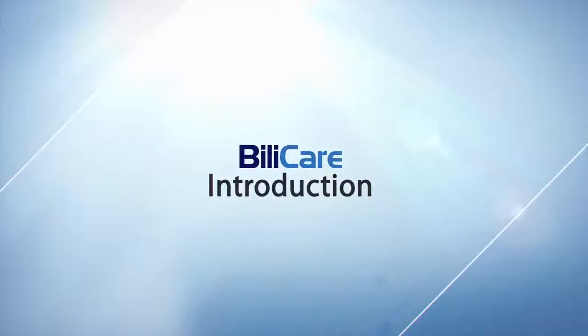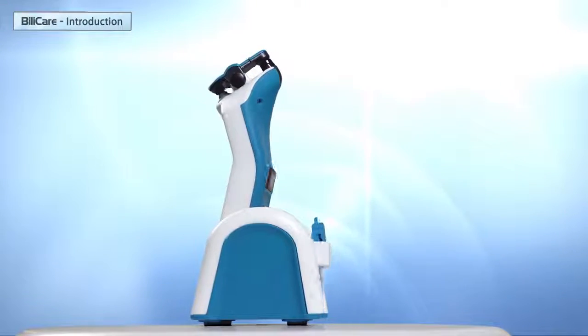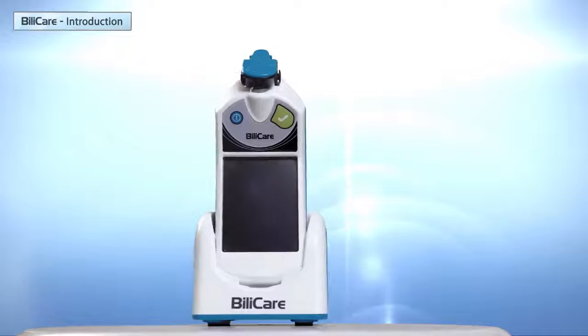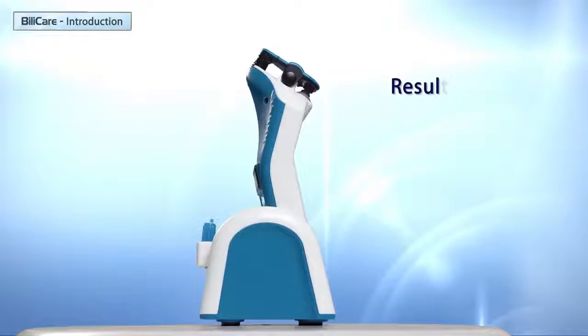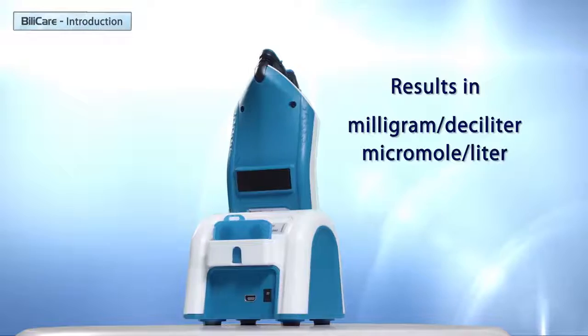This video will show you an introduction to Bilicare. Bilicare is a non-invasive transcutaneous bilirubin meter for neonates. It is a screening device that helps caregivers decide whether a neonate should undergo an invasive blood test for bilirubin measurement. The results may be displayed in milligrams per deciliter or in micromoles per liter units.